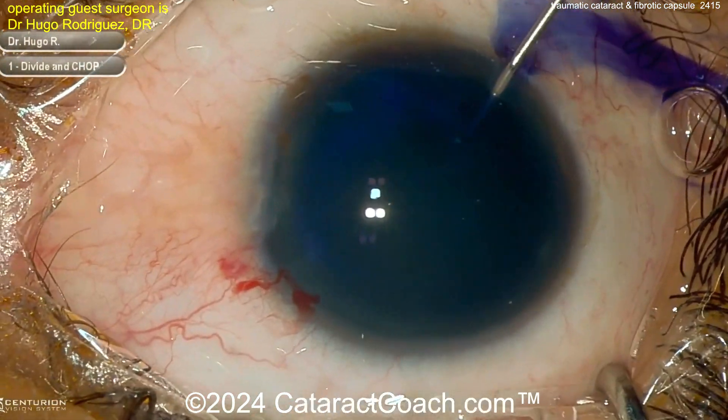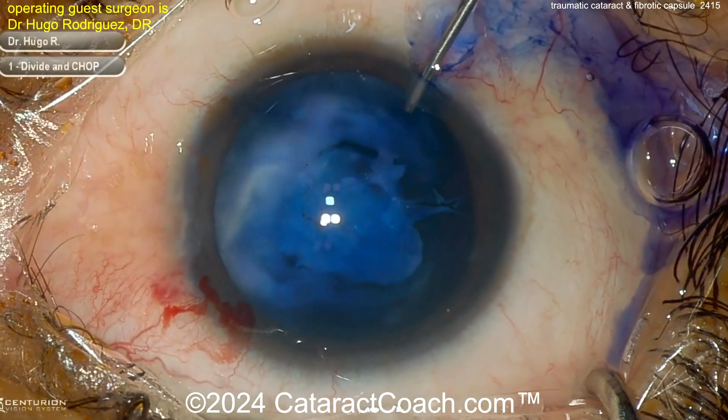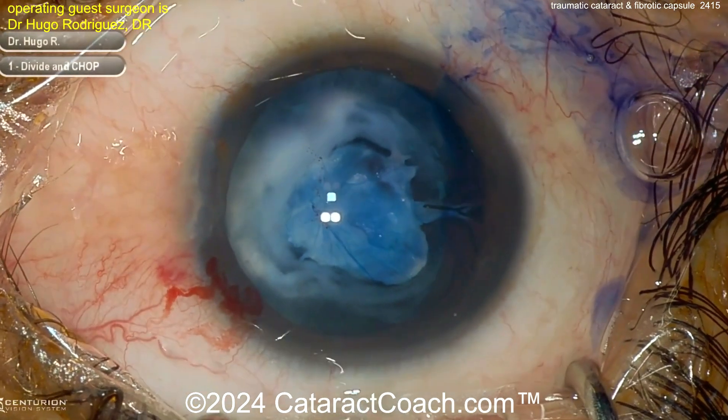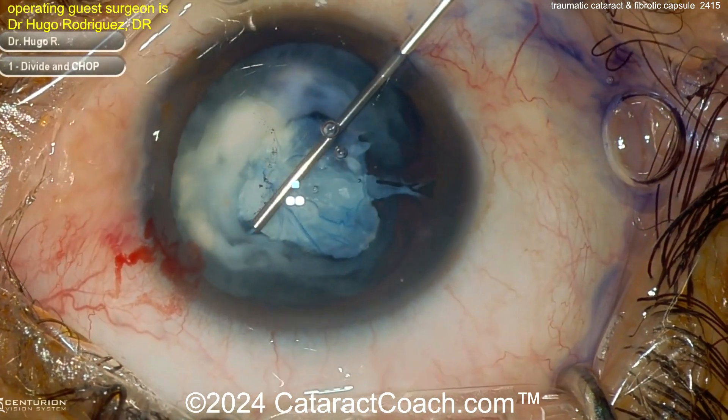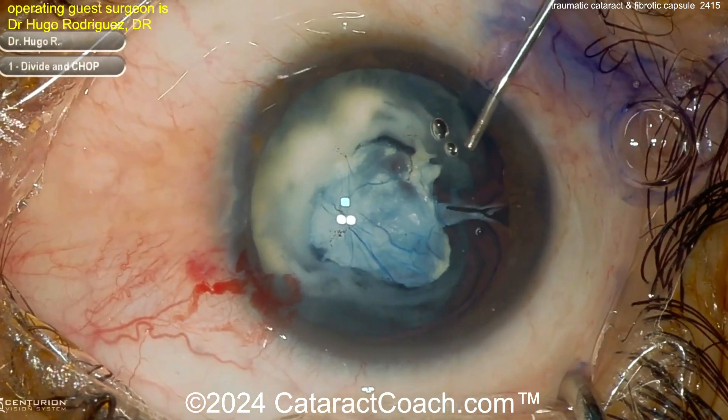Put in a little trypan blue dye now — be careful. If you put in too much trypan blue dye and there's a weakness or deficiency, you may get trypan blue dye in the vitreous cavity, and that could mean a hot mess. It'll ruin your red reflex, at least temporarily.